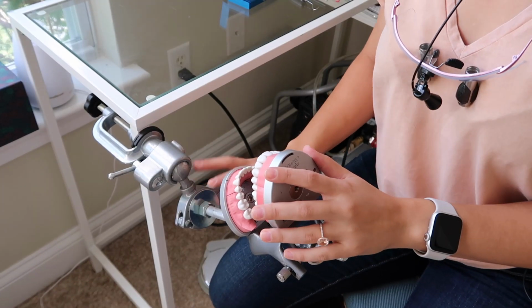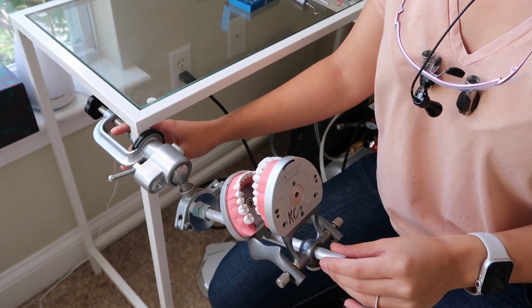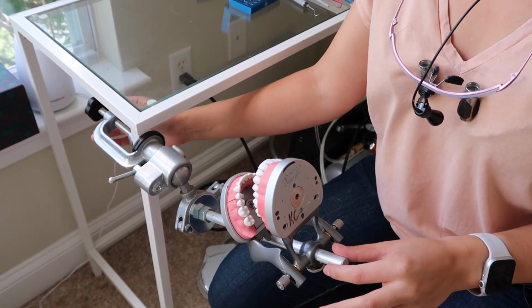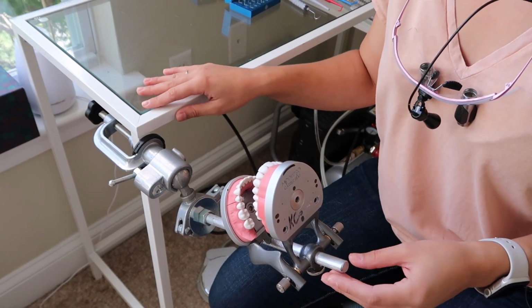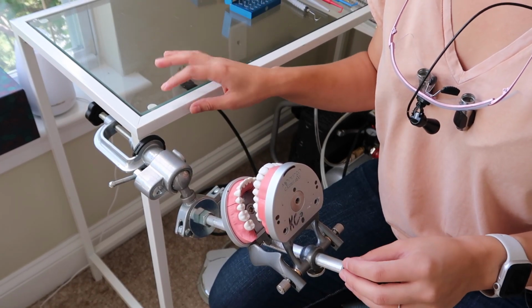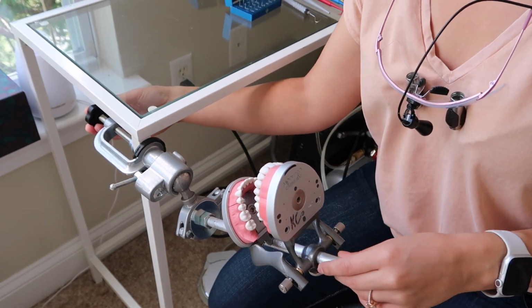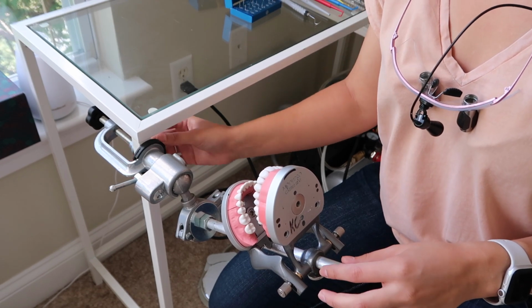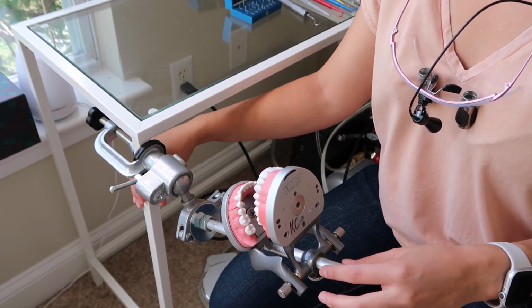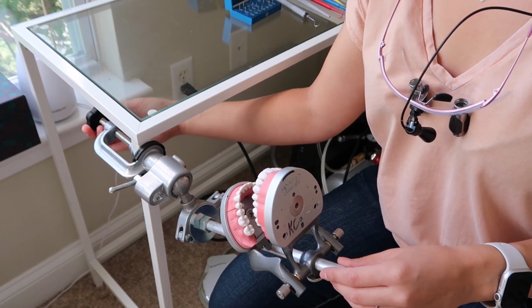So my Typodont is set up on the mounting pole, as I mentioned before. The mounting pole is very easily attached to the table that I'm using. It goes with any table. I wouldn't use it with a wooden table because it would kind of ruin it a little bit. This bolt over here just attaches it to the surface. It does not need a lot of space, so you can see the leg of my table is very thin and it works just fine. So you can just tighten it over here.